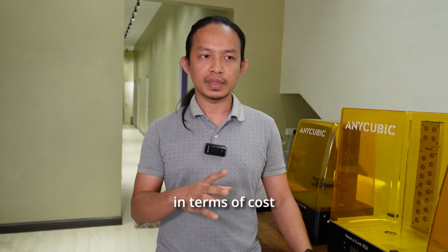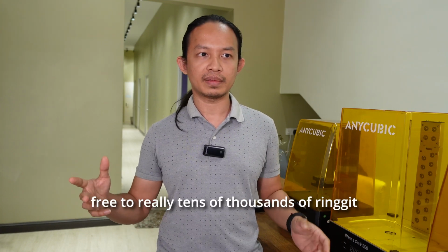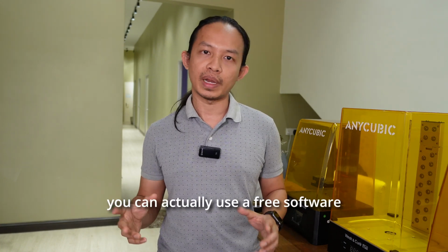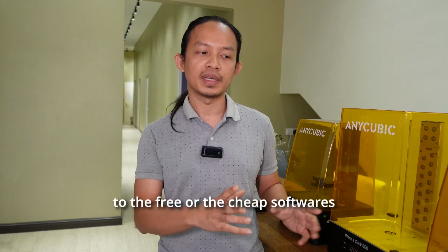In terms of cost, there's a whole range of software, from free to really tens of thousands of ringgit. It really depends on what you need. If you are just doing a few dentures a month, you can actually use free software. There are some limitations to the free or cheap software.